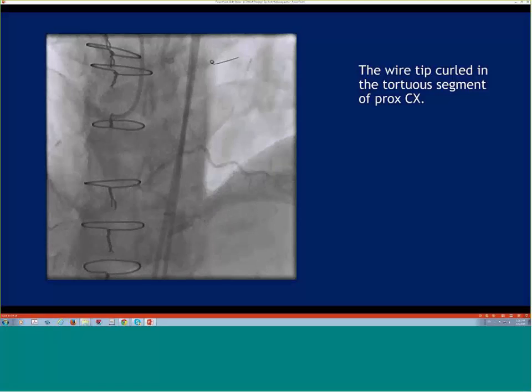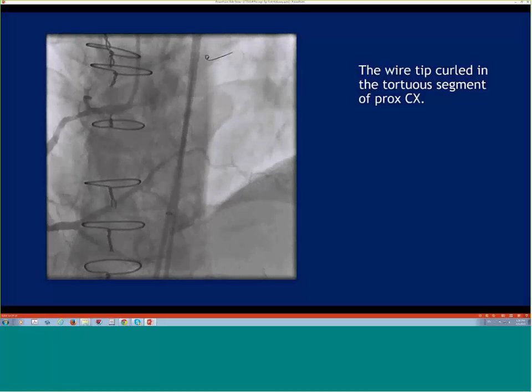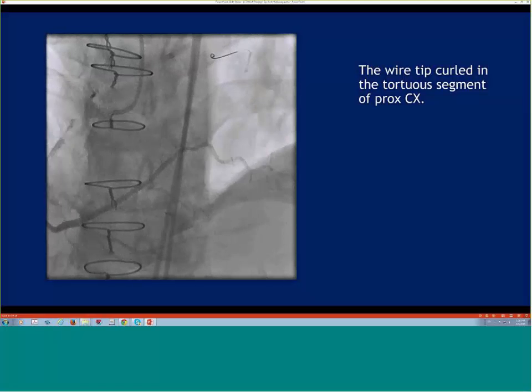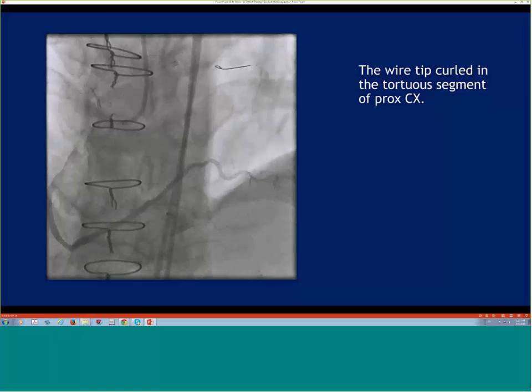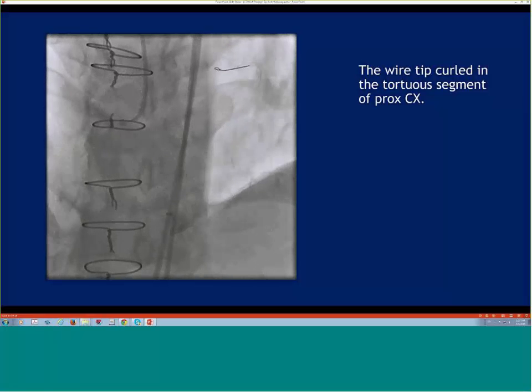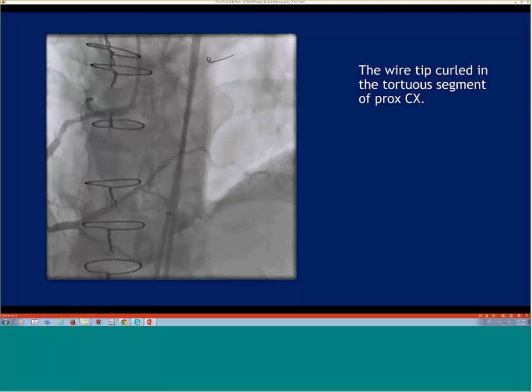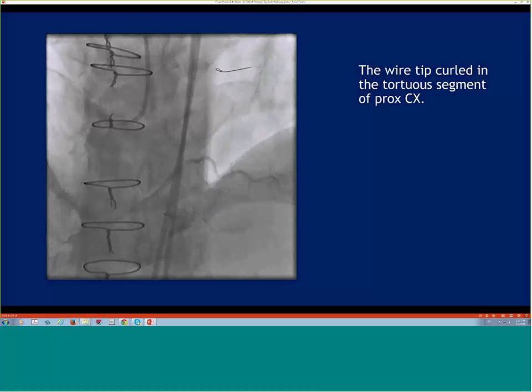No, absolutely. The other possibility there is, I've seen some cases where Corsair does not go and FineCross does, especially in the tortuous epicardials, which is obviously another option there as well. But we did try a FineCross. You did, okay. Yeah, and it wouldn't go, and that's a pretty small catheter. So the fact that it got stuck at the same point, right at the origin of the vessel. Sure.